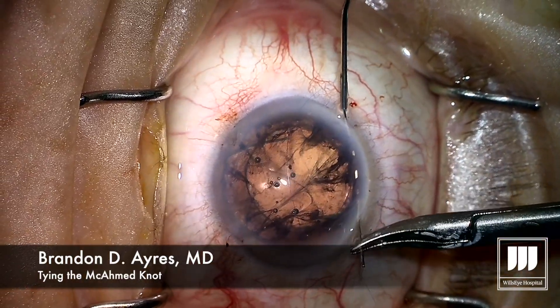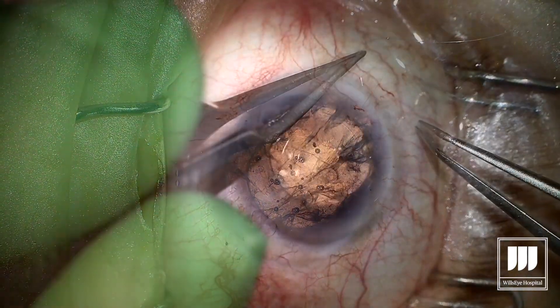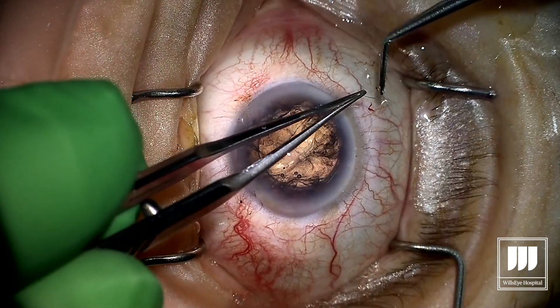We've had lots of questions as to how we tie the McAhmed knot after making a cerclage suture. So in this video, I'm going to show you how we tie and break down the McAhmed knot, named after a combination of Dr. McCannell and Ike Ahmed.